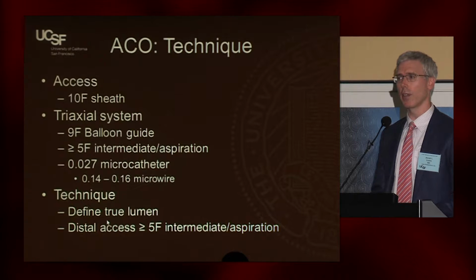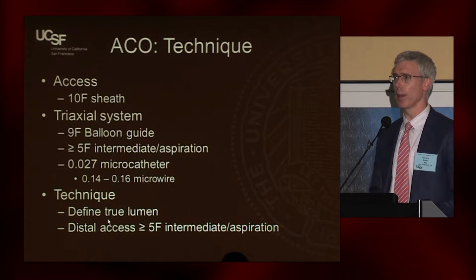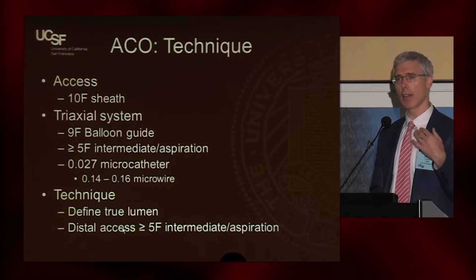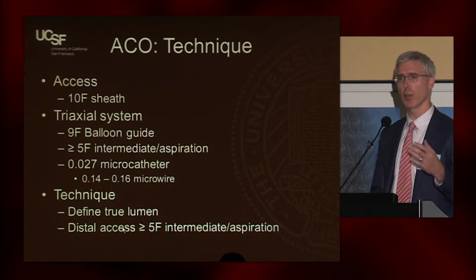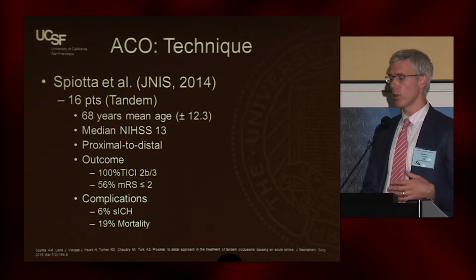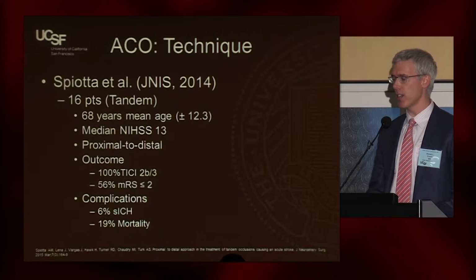Obviously, you're passing a lot of these wires and catheters blindly, so you really want to make sure that you haven't gone into a false lumen or obviously perforated. And then, as I mentioned, you want to get that distal access catheter up as high as possible because it gives you the most freedom to move in and out of a case without having to revascularize or re-access that area.